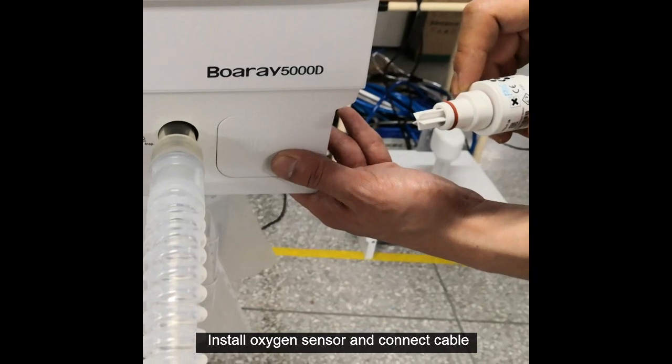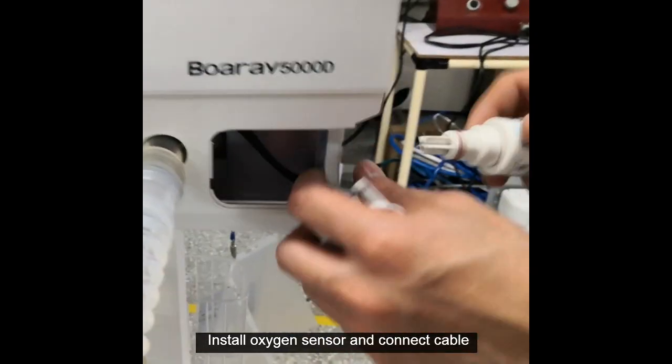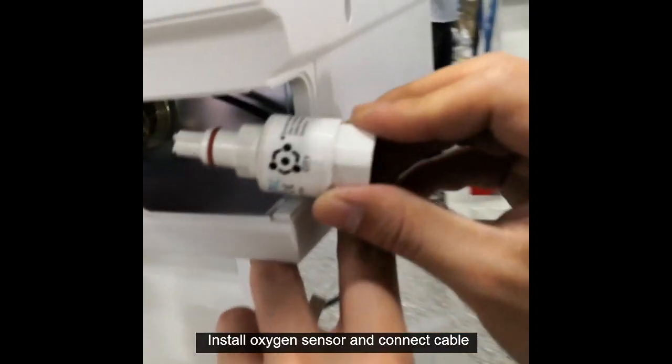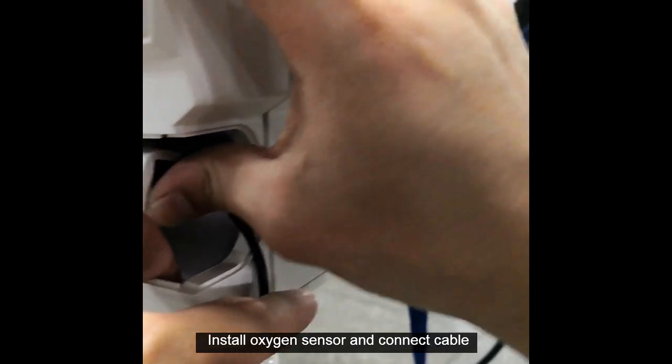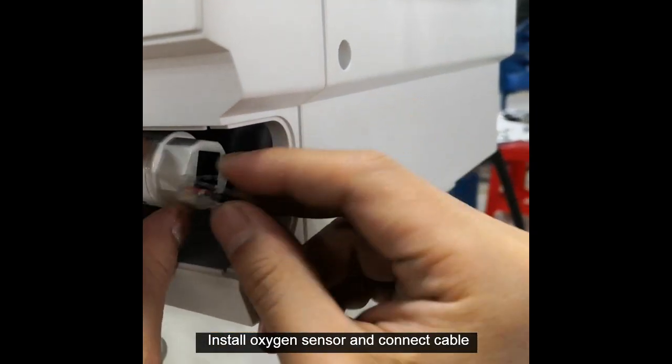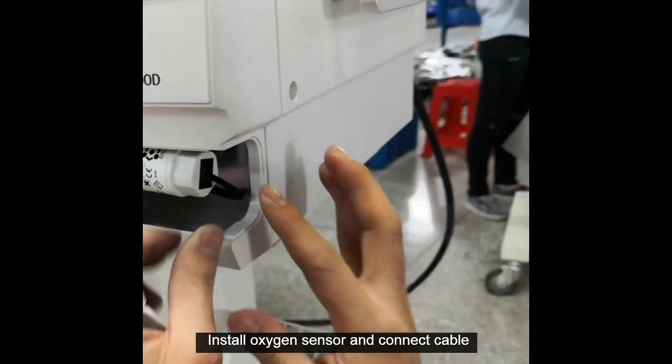Install the oxygen sensor and connect the cable.